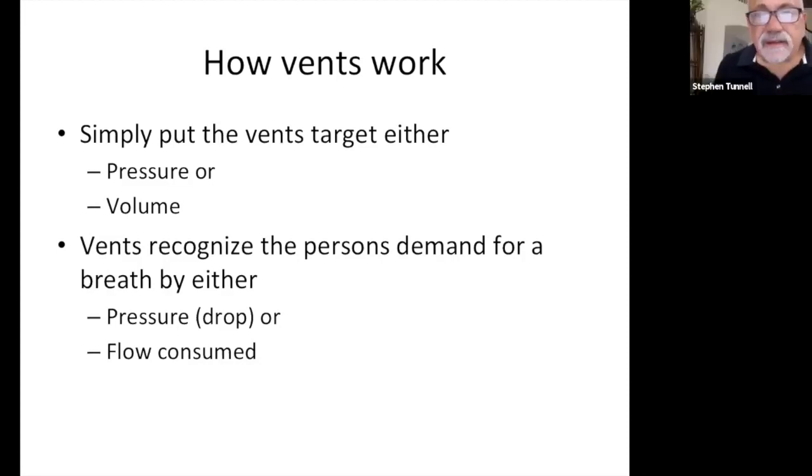So again, how do ventilators work? They simply put either a pressure level into that inspiratory circuit, or they try to drive a volume, a square flow, through that inspiratory circuit. And then they have timing. They open and close the valves to create these breaths. They'll close the expiratory valve and open the inspiratory valve, and gas goes into the circuit. Then they'll close the inspiratory valve and open the expiratory valve, and gas goes out of the circuit. And that's the inspiration of breathing and the exhalation of breathing. We'll look at this in a second.